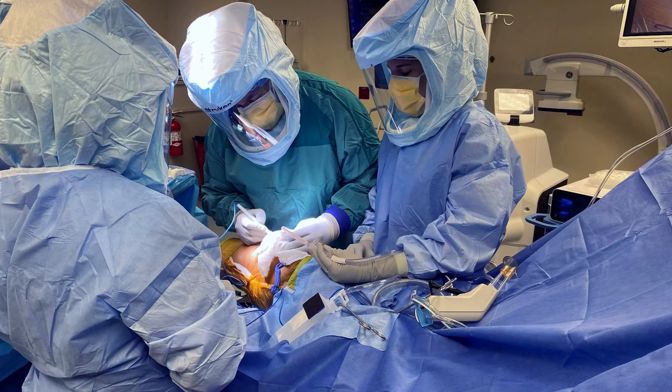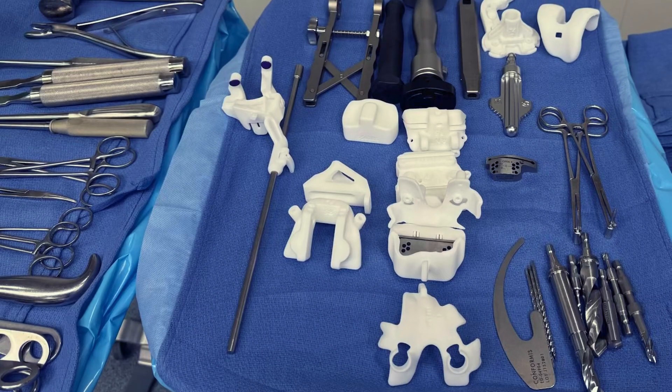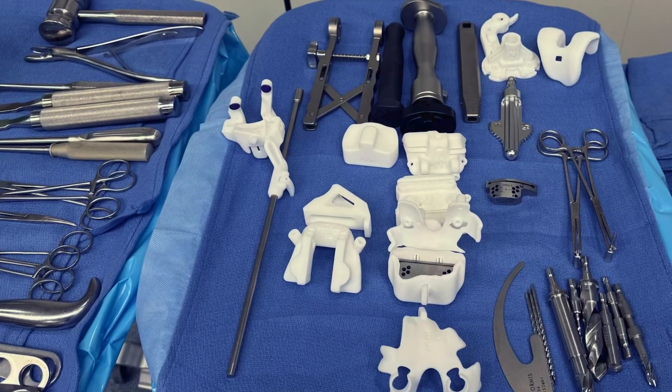Studies have shown that the 3D printed knee has good durability. When we look at patient reported measures, functional outcomes, and implant survivorship, all those things are vastly improved as well. 3D printing technology has allowed me to become precise, efficient, and is now an integral part of my practice.